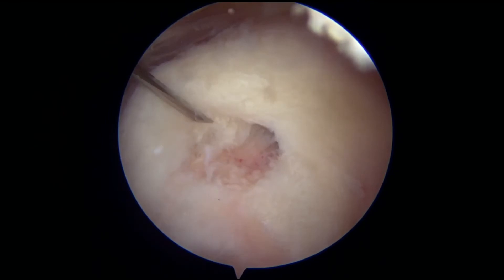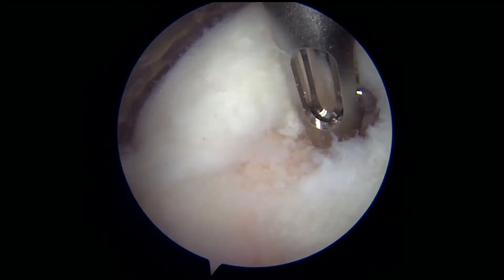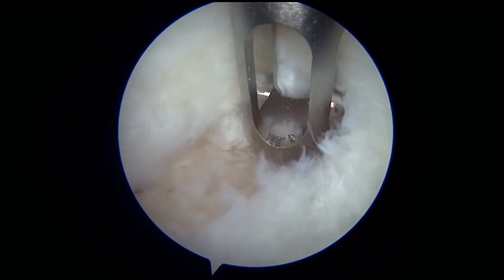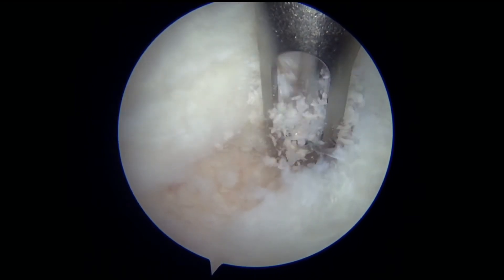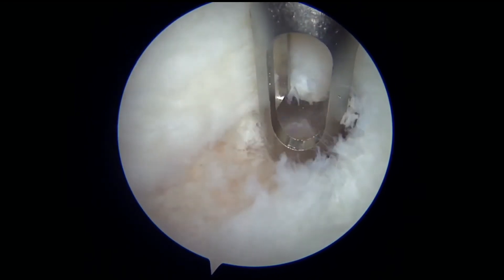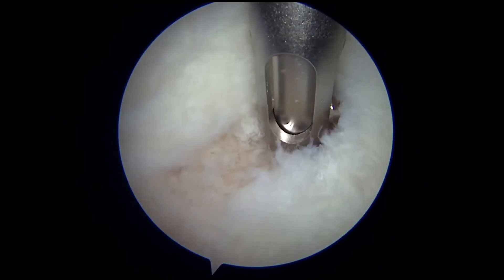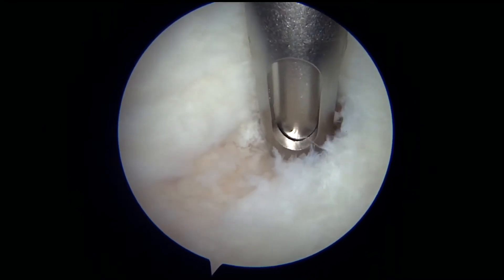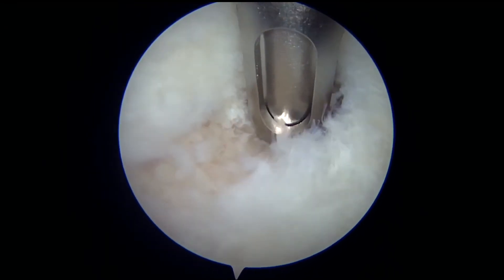The next thing that we do is to get the tendon ready for repair by placing suture into the bone where the tendon actually belongs. So this is a 2 millimeter drill bit that's making a small pilot hole into the bone. And through that drill bit, we can actually place suture. That suture gets secured into the bone, and in this scenario, there is no metal being left in the patient's bone.